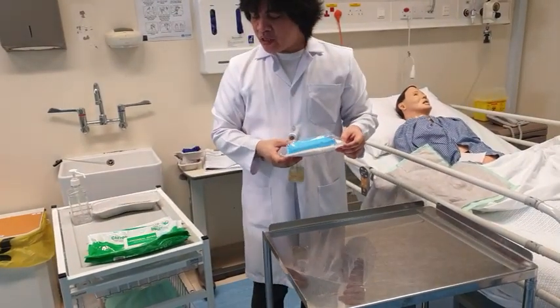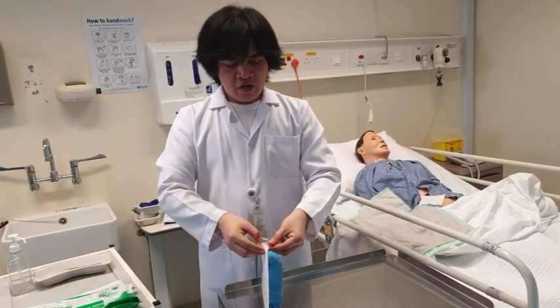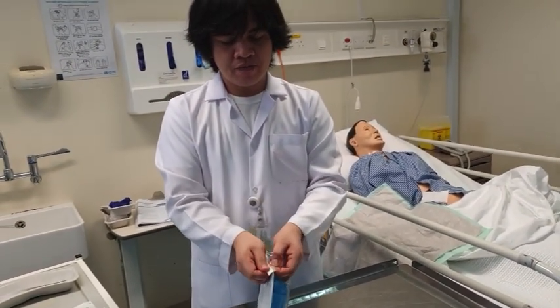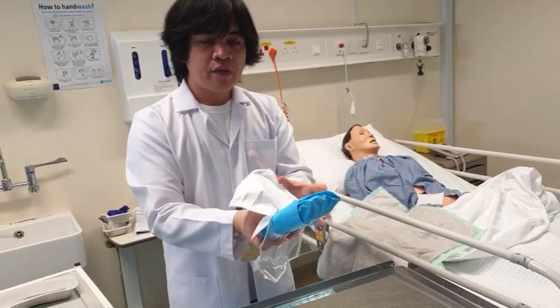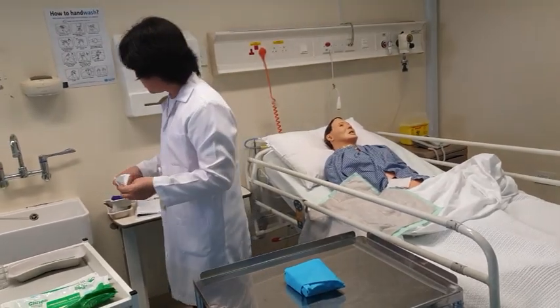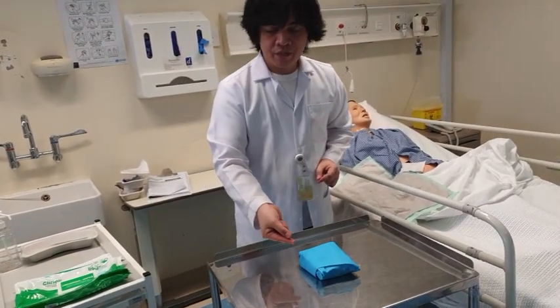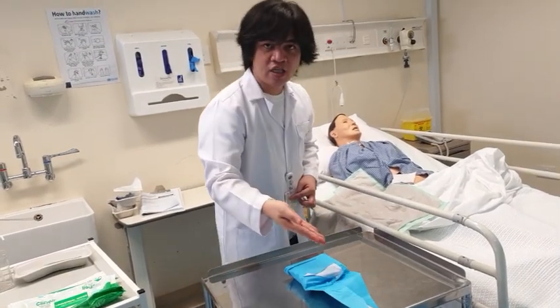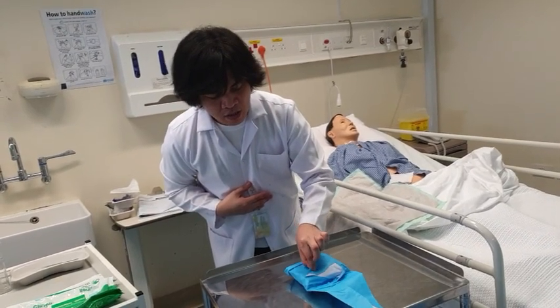The first thing that we're going to do is to set up this dressing pack. You can observe there is a flap here. That means it is where we're going to open with the use of our finger, like this, without touching the inside part. Drop the content of the dressing pack onto the table. Now, how are you going to open this one? Observe that there's a flap here. Loosen the flap away from you without touching the inside part. Again, there's a flap on the other side. Pick this one, open.